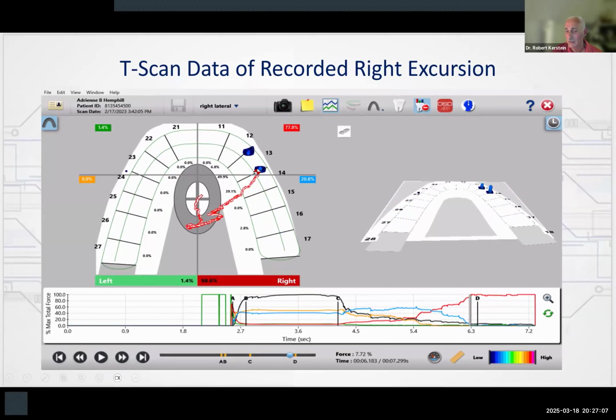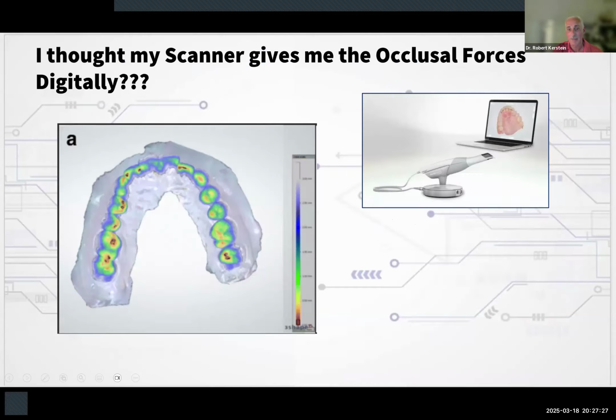So that's about a 2-second recording that shows exactly why she has TMD. She's highly imbalanced posteriorly. She has extreme posterior occlusal forces, and then she can't make a free excursion because she has premolar guidance and blockages on the balancing and working side, right? So that's a diagnosis made in one recording, right? That's the beauty of the T-scan.